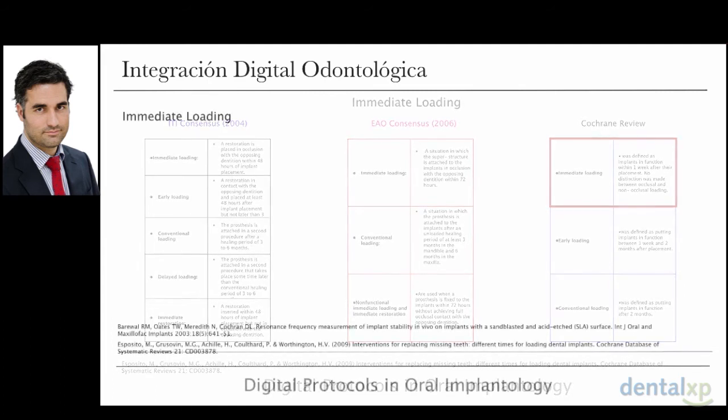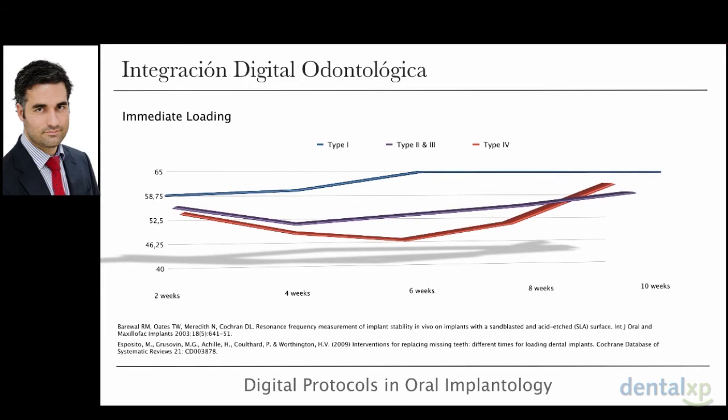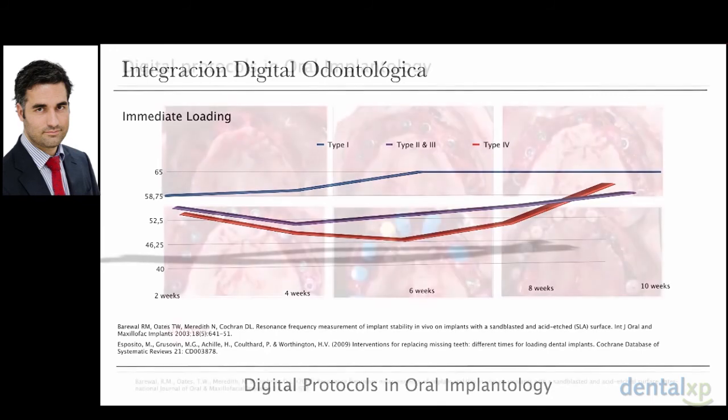You know that it's very important to not handle the implant, to not manipulate the implants after 1 week, because your primary stability is going to decrease, because the bone remodeling starts, and you are going to lose that mechanical stability, and that primary stability is going to be substituted by a secondary stability. This is very well explained in the literature. Some articles from Barewal, you have others from Araceli Boronat, lot of articles.